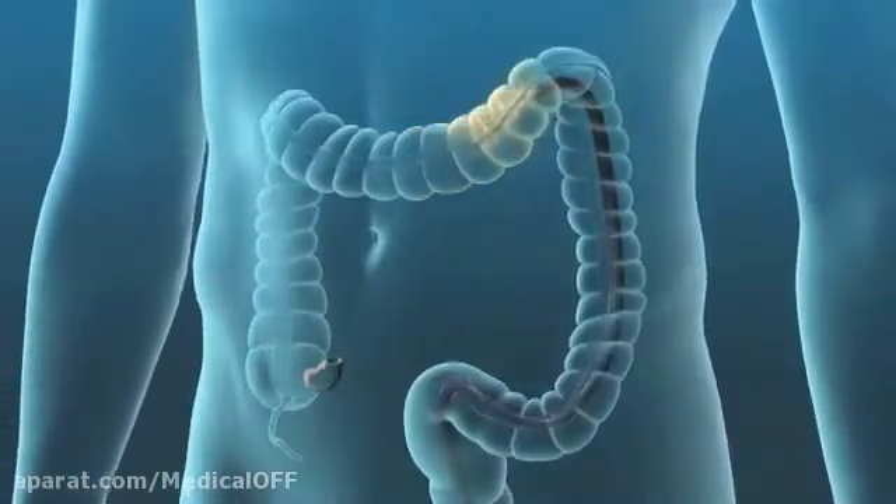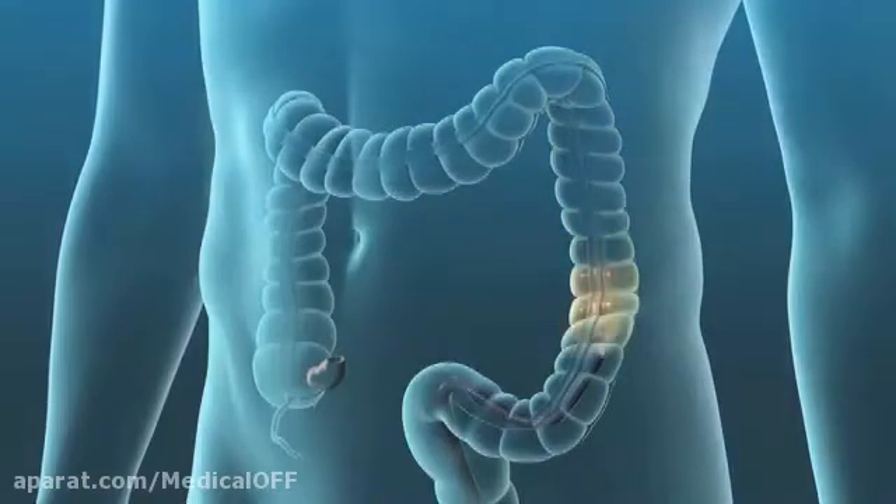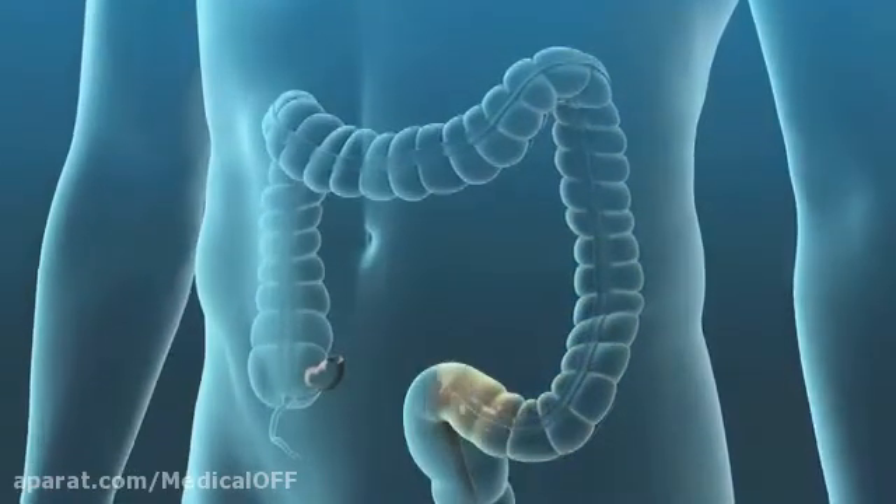At the end of the procedure, your doctor will remove the colonoscope and you will be monitored to ensure the sedative has worn off.